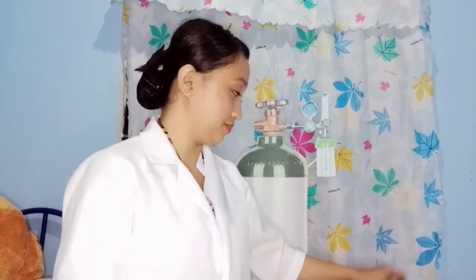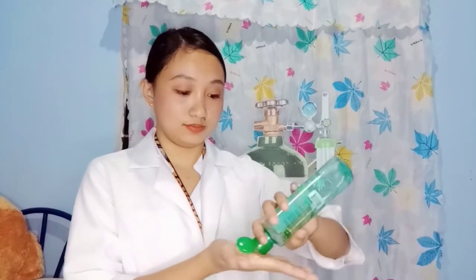And then next, perform hand hygiene and put on PPE if indicated. Then next, identify the patient.